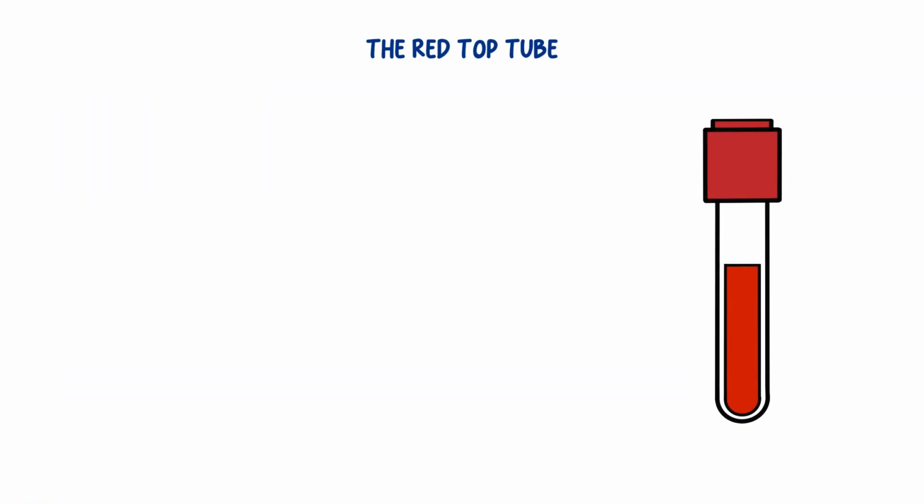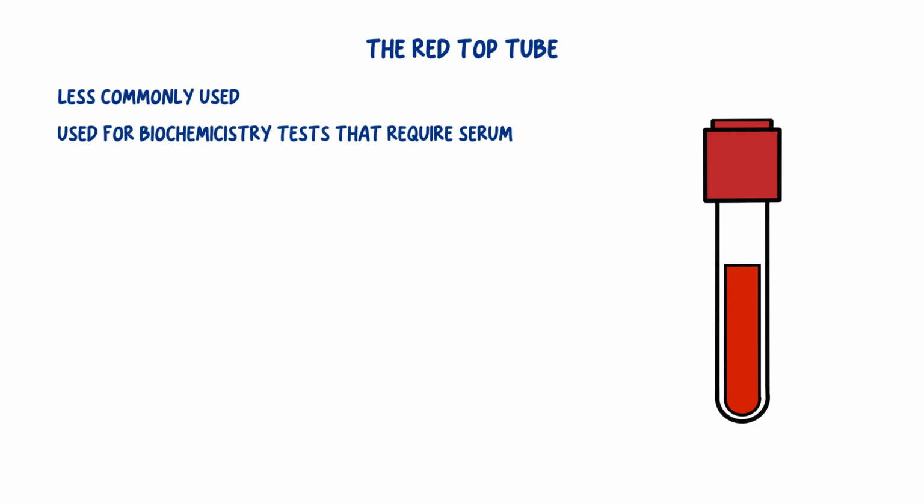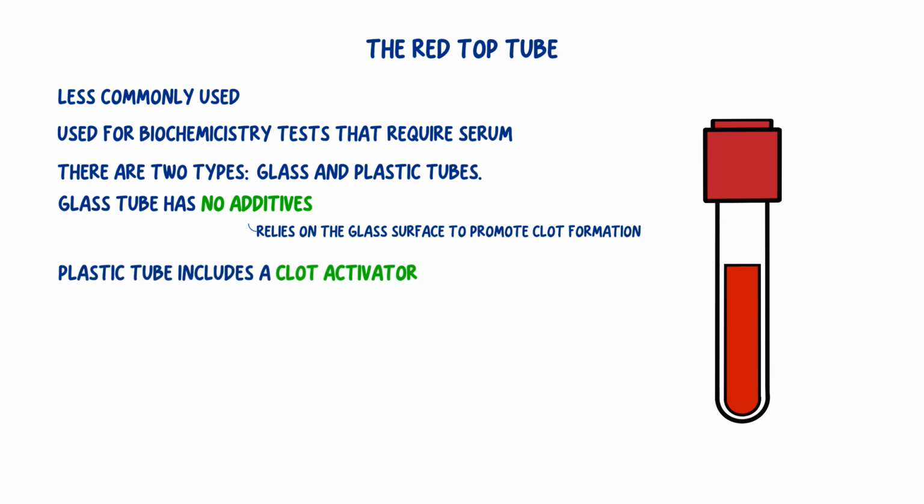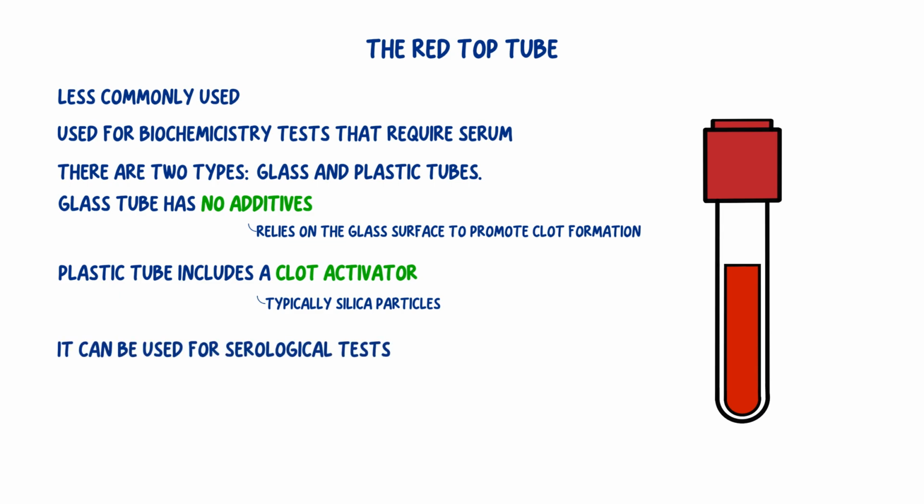The red top tube, though less commonly used, is essential for specific biochemistry tests that require serum, particularly when the separator gel in yellow top tubes could compromise test accuracy. There are two types of red top tubes: glass and plastic. The glass version contains no additives, relying on the glass surface to naturally encourage clot formation. In contrast, the plastic red top tube includes a clot activator, typically silica particles, to expedite the clotting process. This tube is also suitable for serological tests involving viruses, bacteria, or fungi.